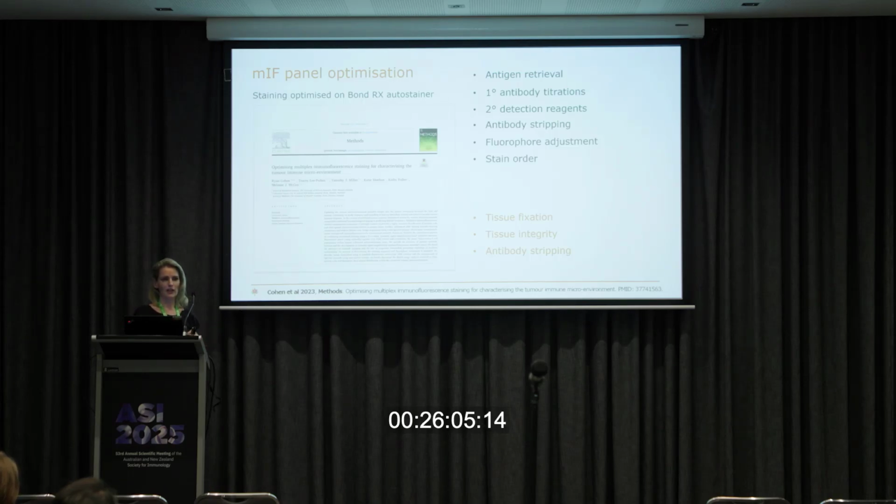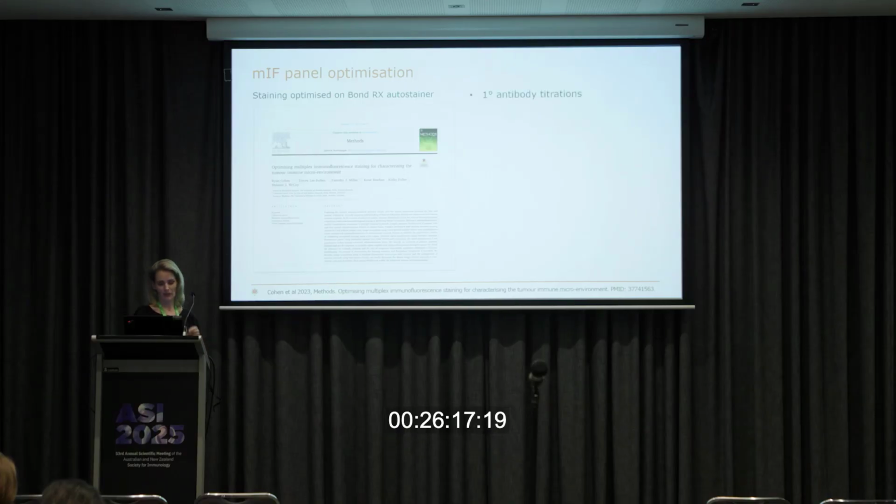So we found that the slide choice was pretty important for us. We've used a slide, the Trajan Adhesive 3, I believe, that was super sticky, so they really help hold on to that tissue. We also had an issue with antibody stripping, so I'll mention that in a second.